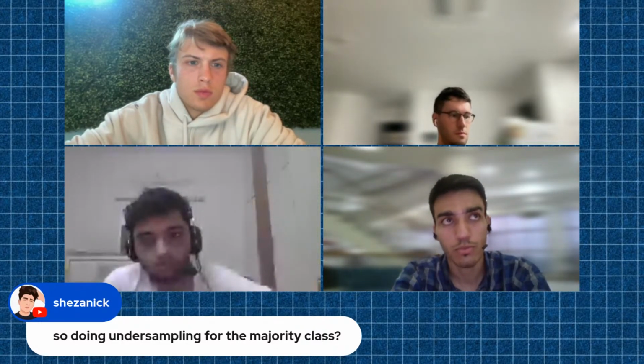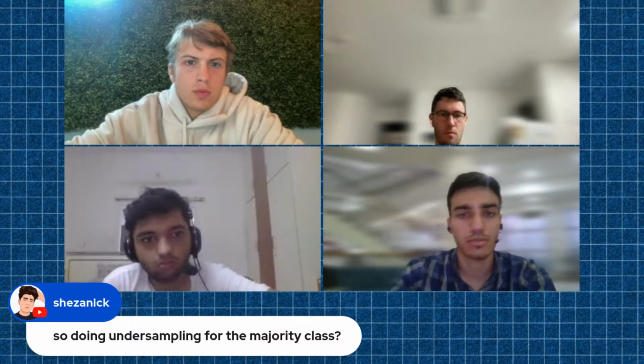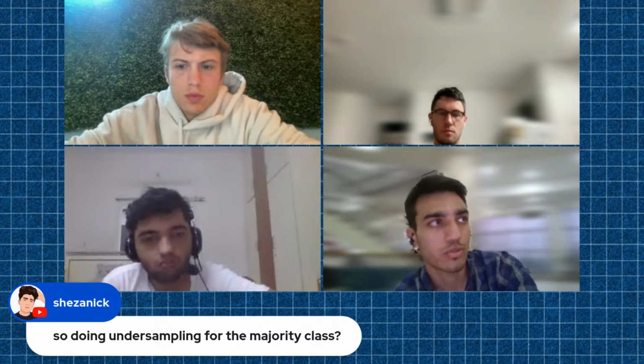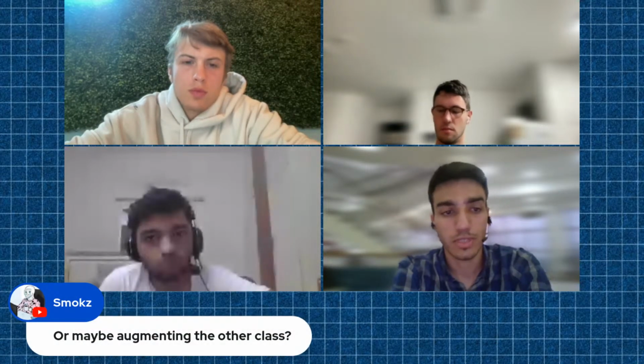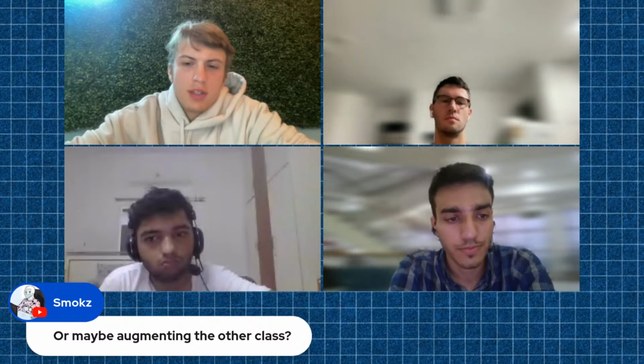How can we do that? One way is to use traditional techniques like simply rotating the images and adding some noise to them. But thanks to generative models, we can also synthetically generate some examples from the minority class. Exactly.